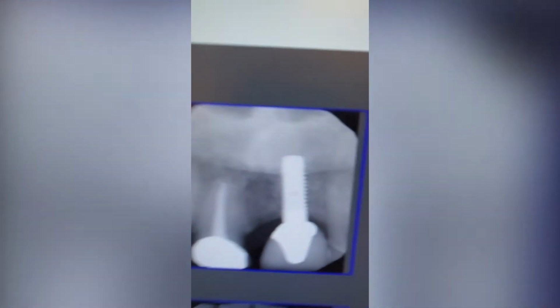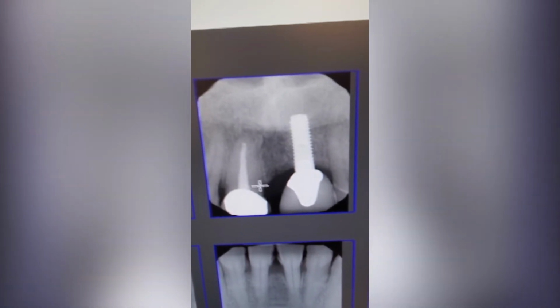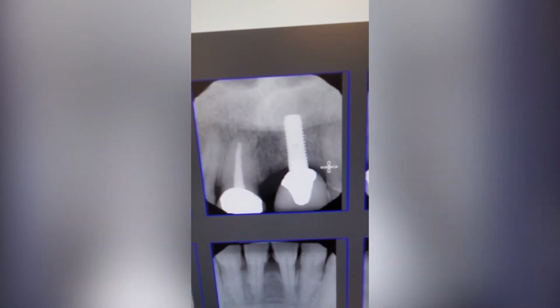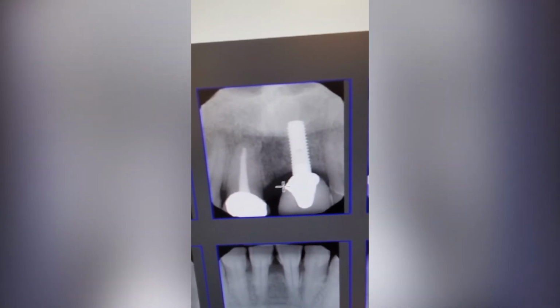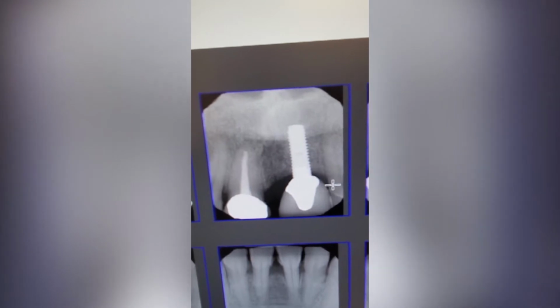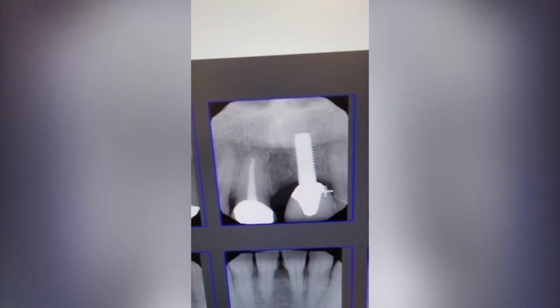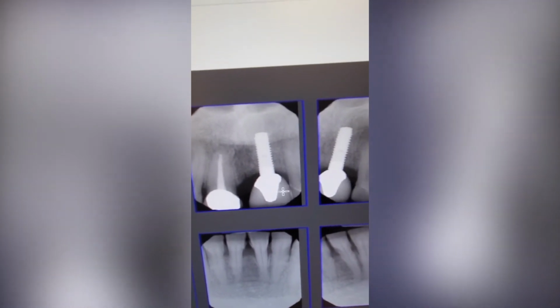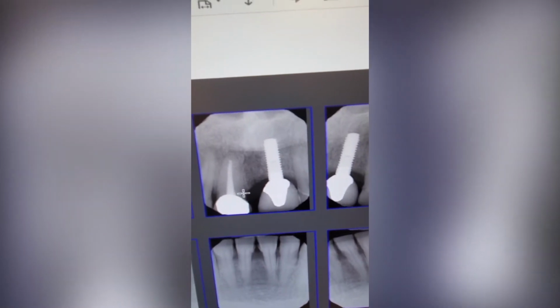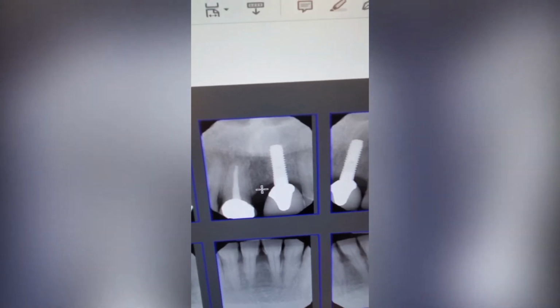Let me start with what the options are. If you look right here, you can see how the bone in this area moves down and sits at the appropriate level, but because of the vertical position of this implant, we'd rather see things up here. By moving the bone and the implant up this direction, we can also move the soft tissue. Your options would be to take the implant out, start over, fill this up with bone, and hope it heals in a reasonable way, trying to increase the vertical height, which is a tough move.